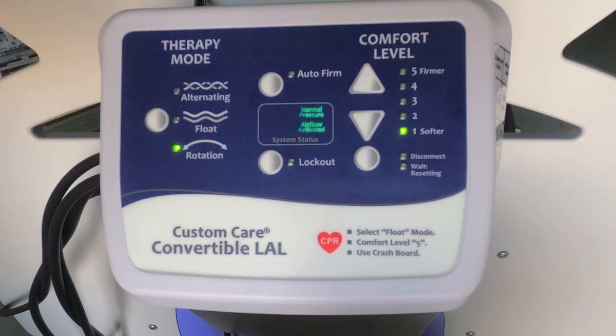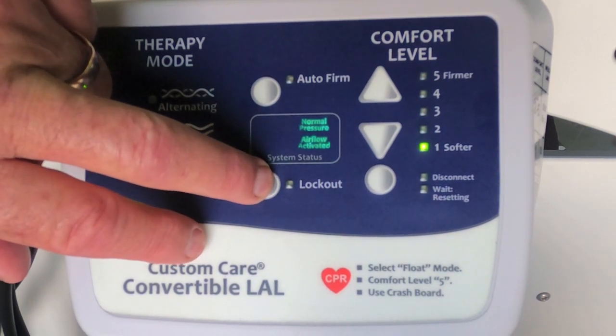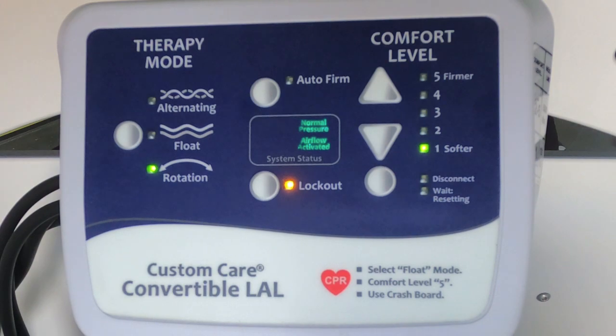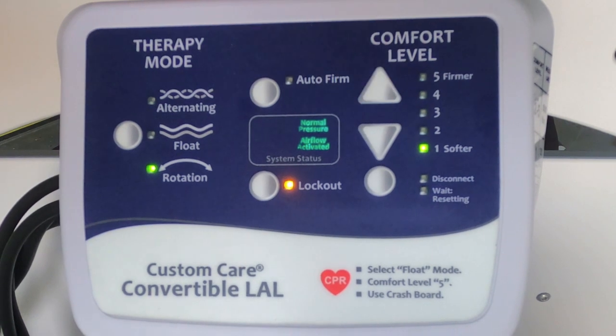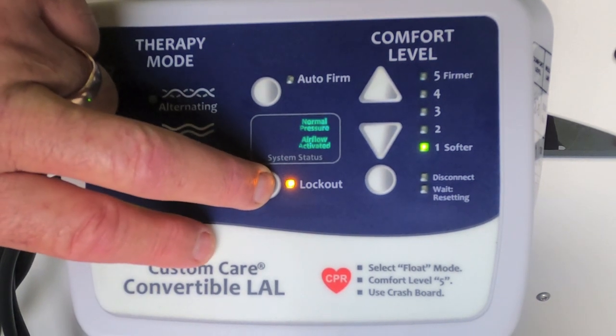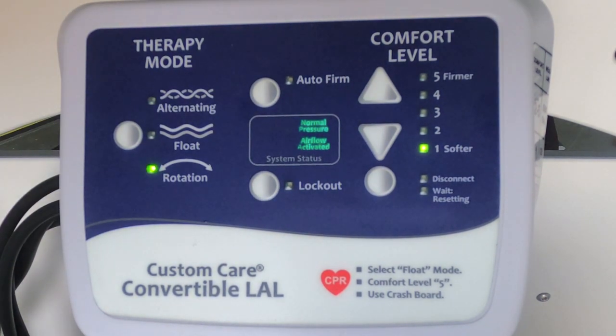Another feature is the lockout, and that's a safety feature. It basically assures that the settings are consistent and there's no accidental or unintentional change made to the settings. And I suggest that when you're making your rounds, you assure that your controller is locked out. That way, if our environmental services wipes this down, if a family comes in and is curious, none of your settings are going to be changed, and you should really check this and make sure this is right at least once a shift. If you come in the room and the lockout is turned off, then the settings could have been changed by someone. It's vulnerable in that mode.